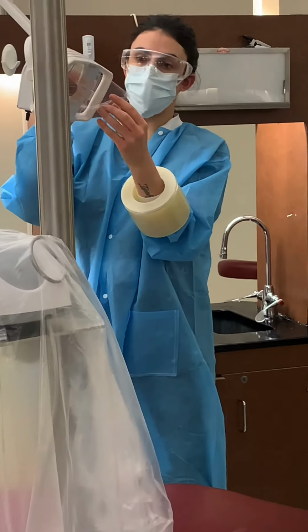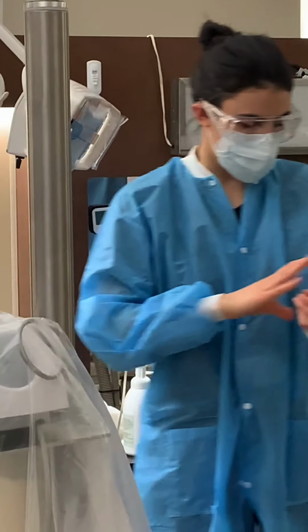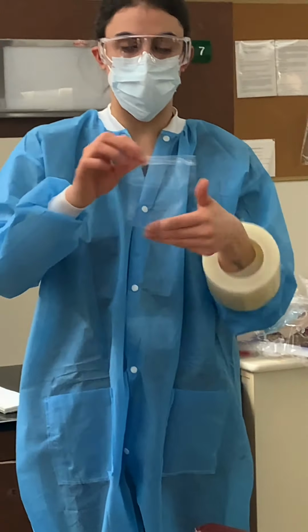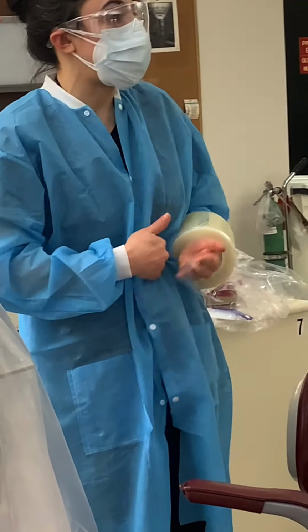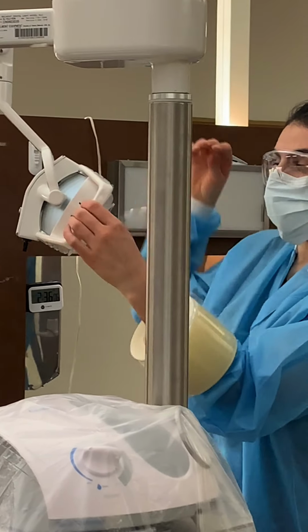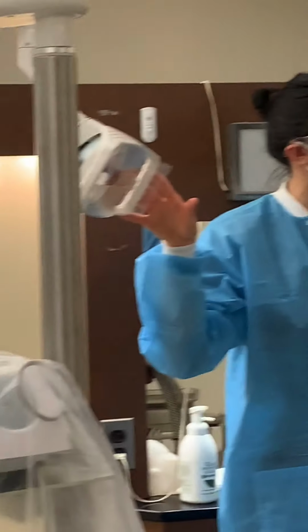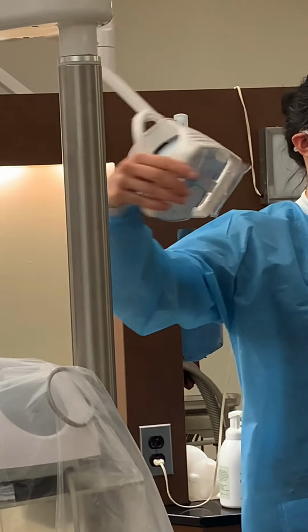So you'll put that on like this, and then bring it out, let them kind of kiss together. Same thing on the other side. And again, this would be a clean gown, so it's not like I'm touching this to patient blood or patient saliva that was on this gown. So these are two high touch areas we'll put on here so that when the operator was to grab, it needs to be double-sided because even though you might have a dentist on this side, you guys might be doing the light for the dentist, so you might have to grab it on this side too.